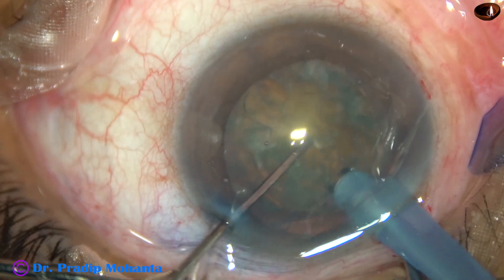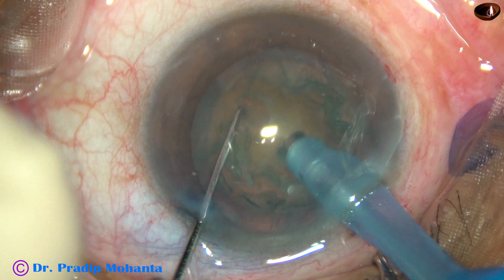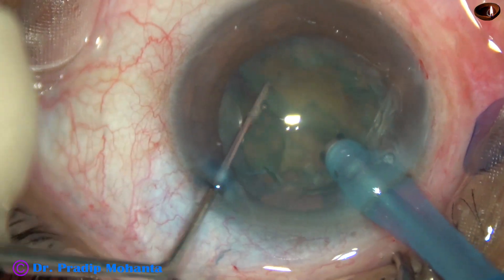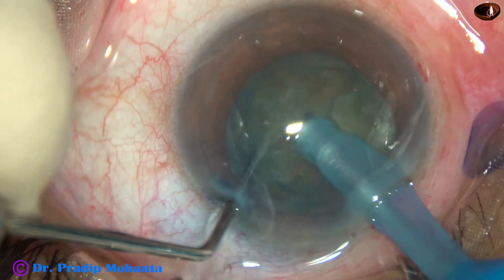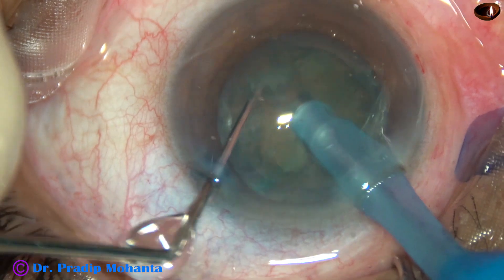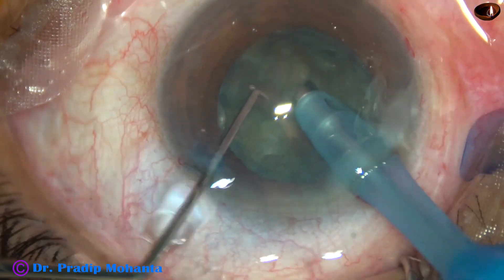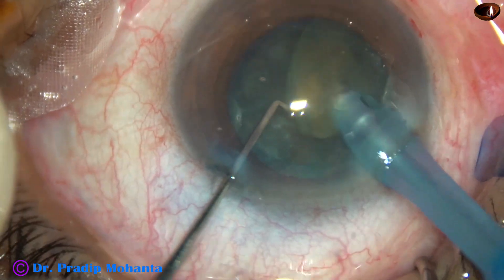Now watch the mechanical chop technique. The tip is buried into the substance of the nucleus, then you come back to irrigation — no aspiration. Come back to irrigation, support the nuclear mass, and use the chopper to slice the nuclear mass. Each heminucleus is sliced into fragments. When you support the lens mass with the phaco needle in irrigation without using vacuum, it is called mechanical chop.